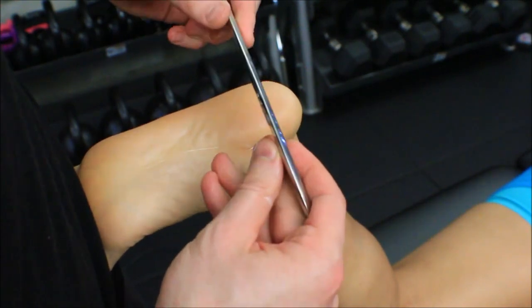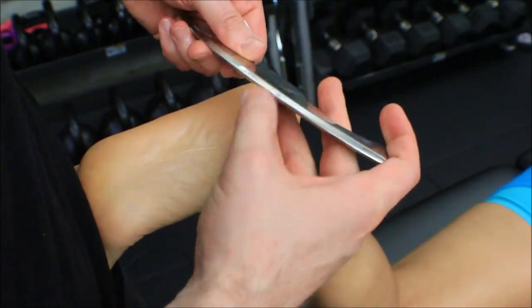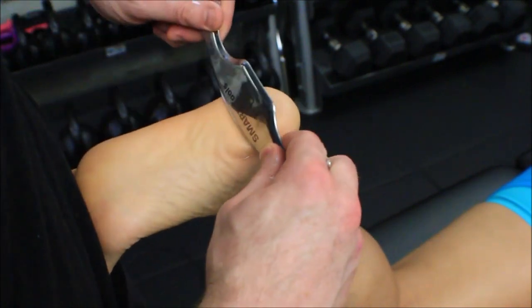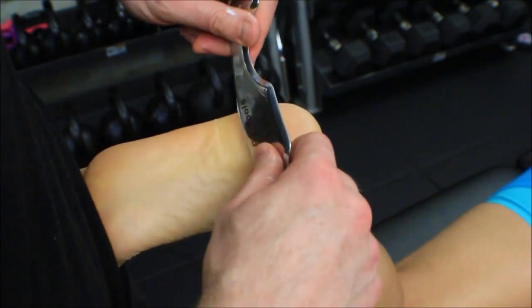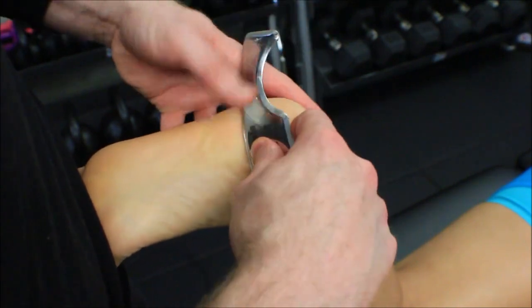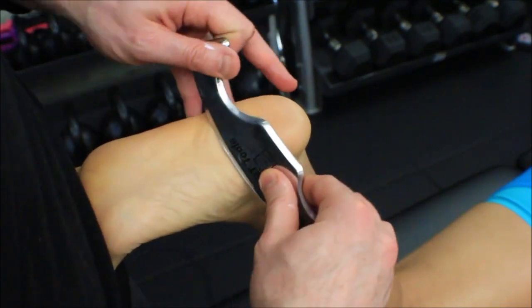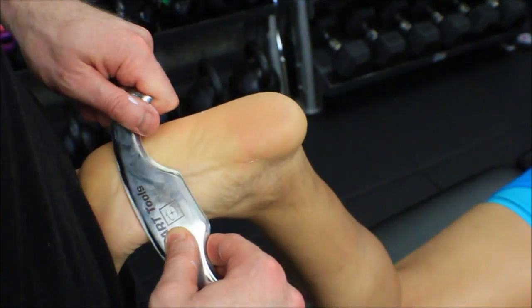Notice it's double beveled, which means each side has been sanded down, and these are just a little duller than the single beveled ones. All right, so what I'm going to do is just pull through the tissue, noticing any differences. You guys see how I push in till I get a little kickback from the tissue. So I'm going through the softest, most superficial layers and then just dragging through, noticing any differences. And I definitely notice a little bit of difference here in the medial longitudinal arch.